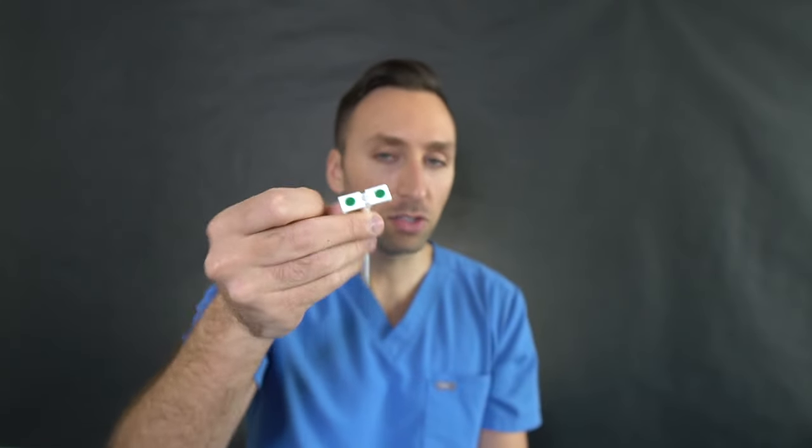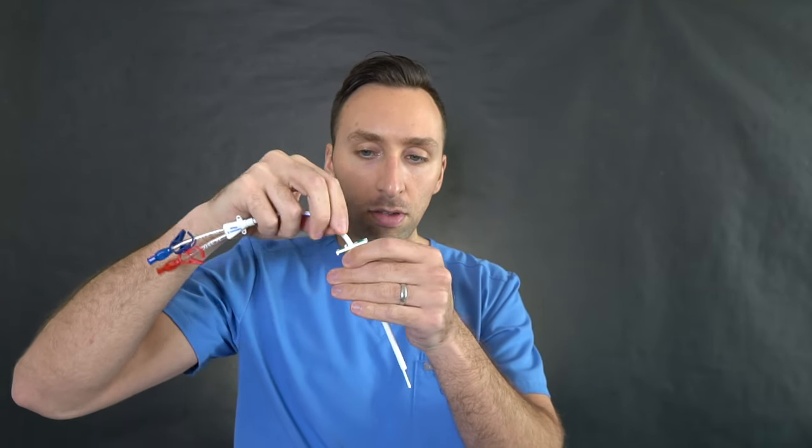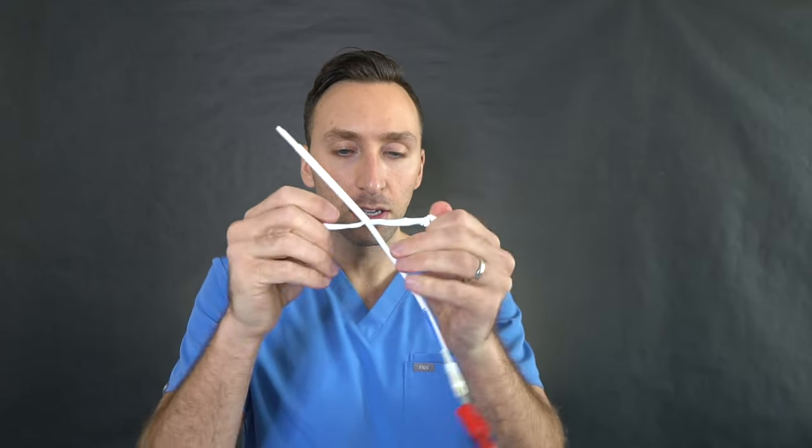So you can see this nice big 15 French catheter can go through. Once we dilate up the tract, we put in our peel-away sheath over the wire. Once we have that in place, we have our tunneled catheter hanging next to it. Then we remove the inner stylet of the sheath and the wire itself. You want to put your finger over this because it'll bleed like crazy — you have a big hole that size in the jugular vein. You then thread the split-tip catheter through the peel-away sheath. Once you have it in the sheath, you break apart the sheath and peel it open — the catheter stays in place.